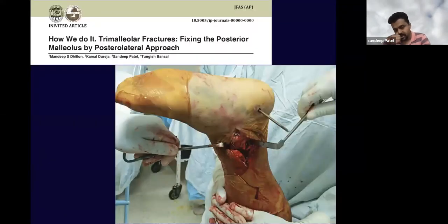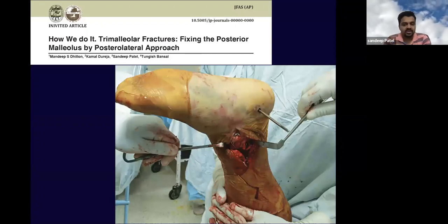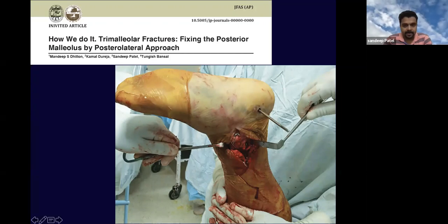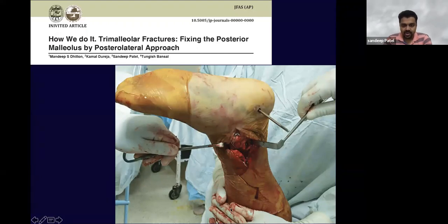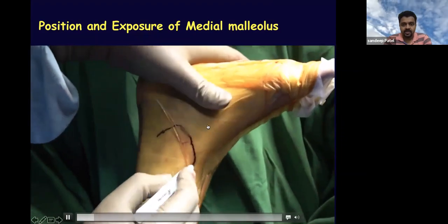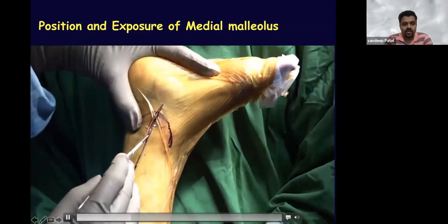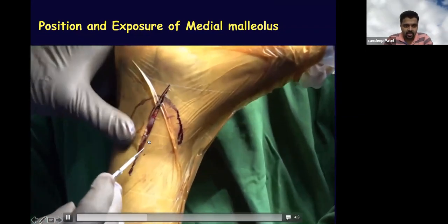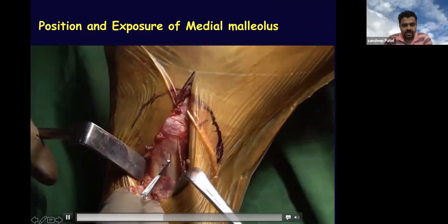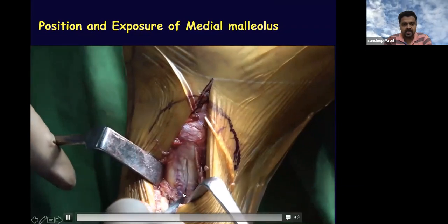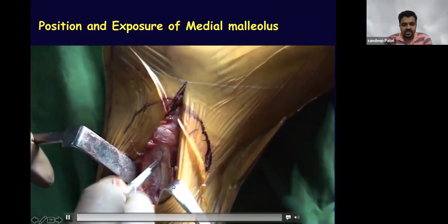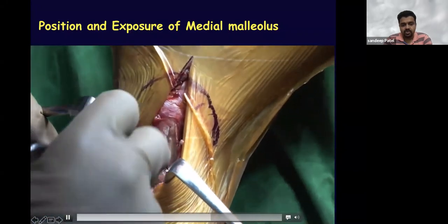Once the posterior malleolus and fibula are fixed, next is the medial malleolus. In the prone position, the assistant flexes the knee and holds the leg — this is the view we get and how we operate. The leg is lifted, the medial malleolus is marked. As this fracture pattern was posteromedial, the incision goes posteriorly. The fascia and periosteum are cut, and we can see the fracture surface exposed.